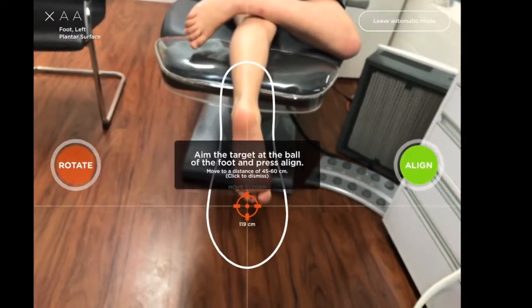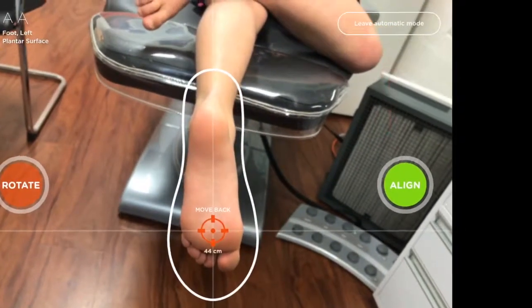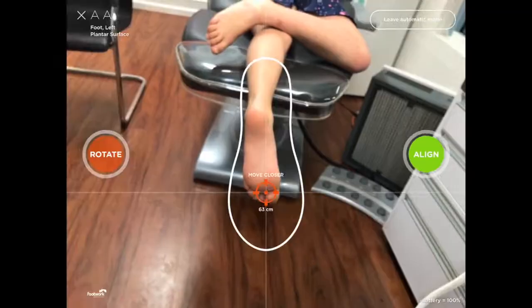So what is it? Well, the update is this new option up here in the right-hand corner of the TechMed app, which allows you to leave automatic mode and enable the adjustment of the bounding box.